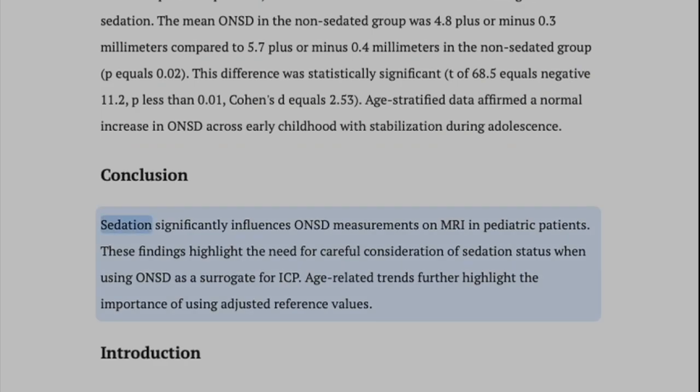Conclusion. Sedation significantly influences ONSD measurements on MRI in pediatric patients. These findings highlight the need for careful consideration of sedation status when using ONSD as a surrogate for ICP. Age-related trends further highlight the importance of using adjusted reference values.